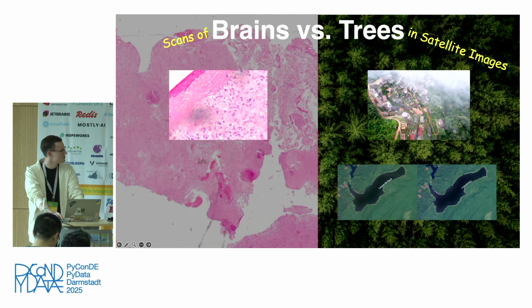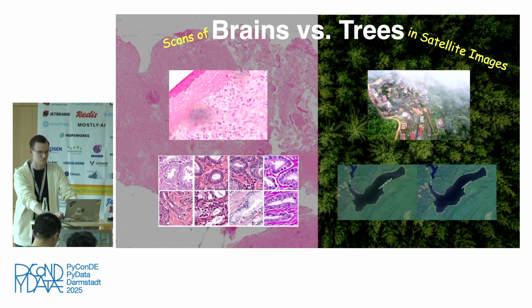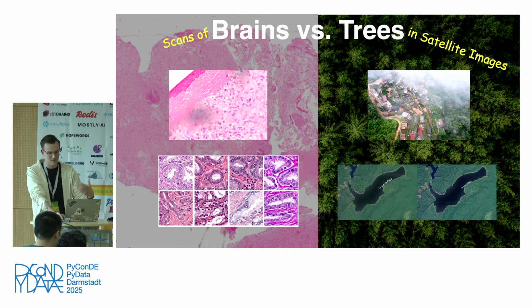If we continue, you can see it a little bit with the contrast. This image has a better saturation than this one, simply because it was another satellite making the image. And if you go into pathology, we have exactly the same problems. If another person is applying the staining to the image, it looks different. If you use a different scanner, it looks different. So we have many, many common problems in this area we have to tackle.